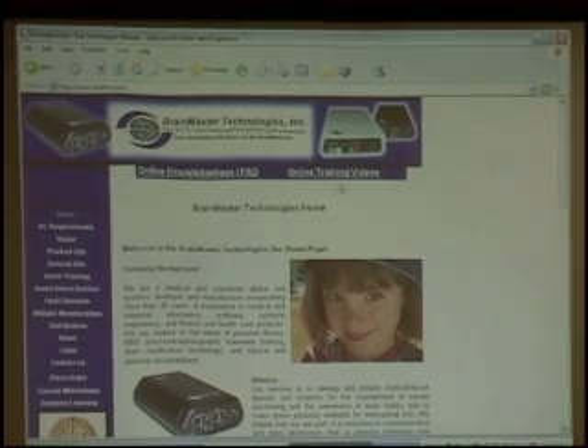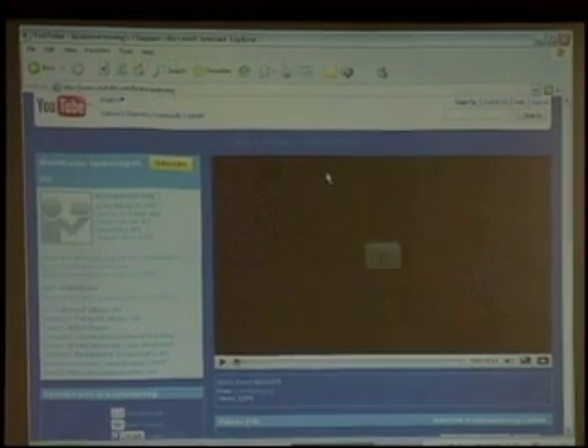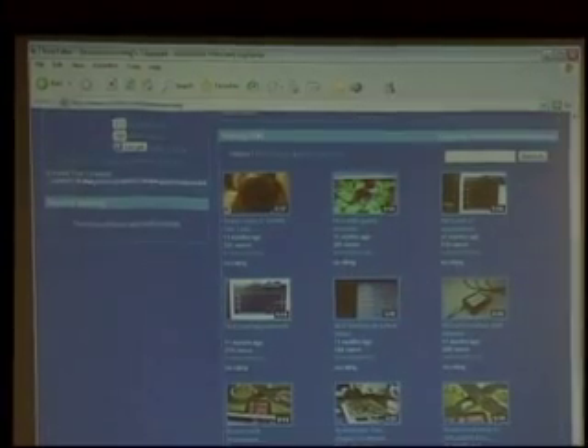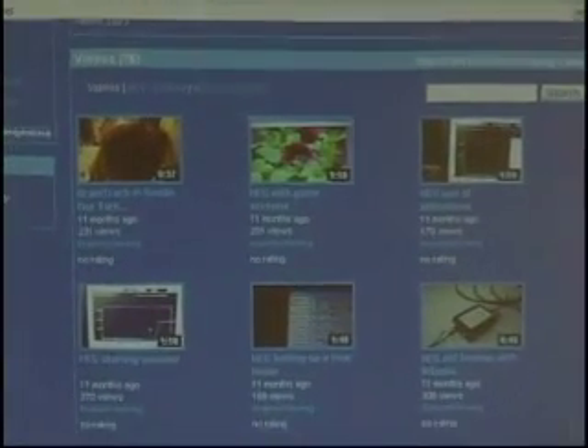Let's take a quick glance at the training videos. If I click on the training videos here, you're going to see it takes you to a section of YouTube that Brain Master Technologies has, and we have about 76 or so different videos listed.